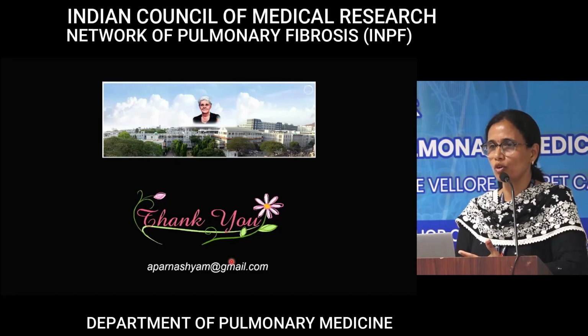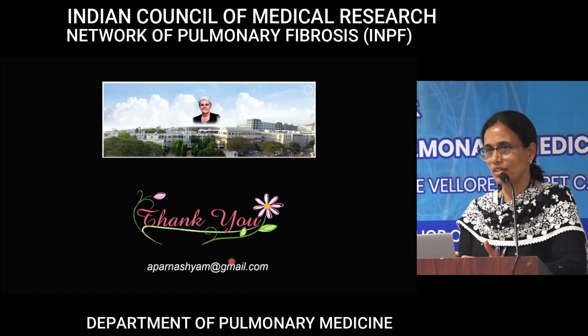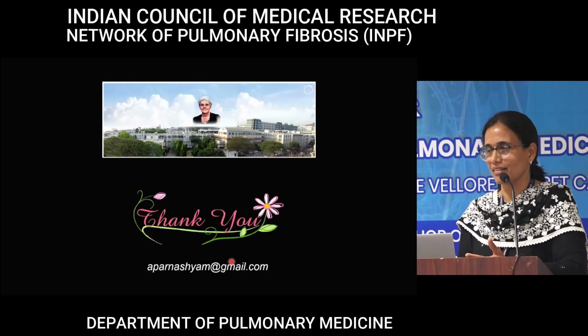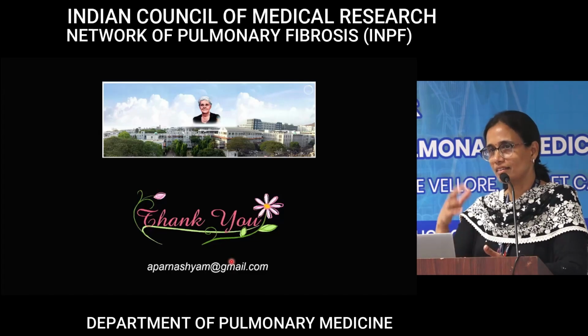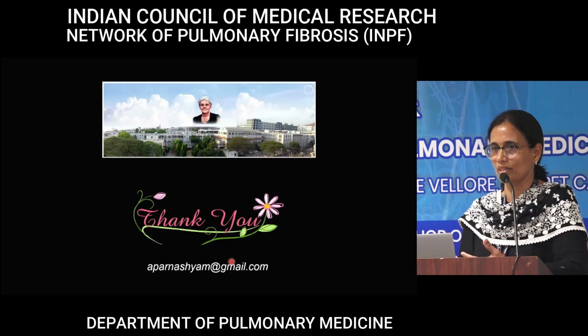Second question was about the esophageal dilatation. So usually this is an esophageal dysmotility, so the entire esophagus will be dilated. Is there a cutoff, like when do you say it's dilated? Some people say 18 millimeters, but I don't think any of us is actually sitting and measuring the esophagus. It is a visual thing, and it is usually the whole esophagus which is dilated. If it is just one small segment which looks a little dilated, it may not be significant because maybe it's some peristalsis or something. So usually it's the entire esophagus.